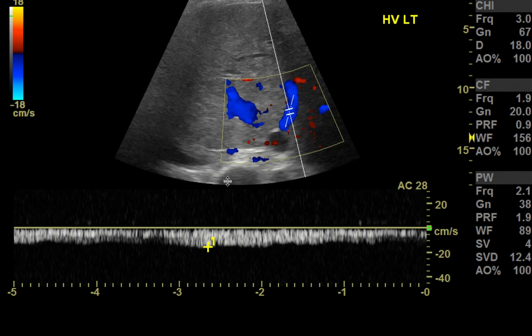And this can be from a couple different things. One of the things that we think about when you see a flattened appearing waveform is, is the liver coarse? Is there some kind of coarsened nature to the liver that, when you're getting the backflow from the heart, prevents us from being able to see the correct undulations of the normal ASVD waveforms, and it can appear flattened. So you can see this with severe cirrhosis, but you can also see it if you have failure of communication between the hepatic vein and the right heart. If that's narrowed or if there's some kind of obstruction in there, you can also see this as well.